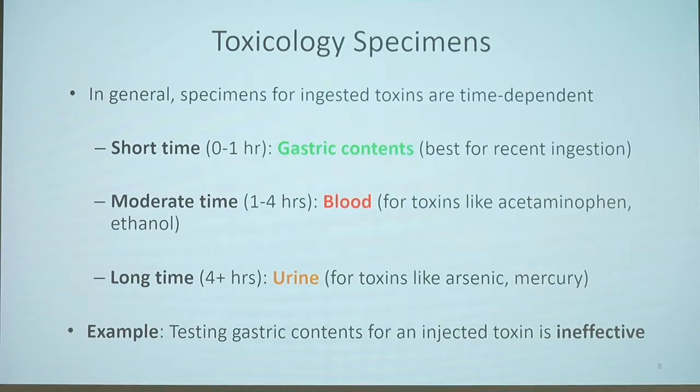Not all of the sample has been absorbed into the blood, so you can pull out a sample and test it for whatever you suspect or for a panel of different drugs or toxic agents.